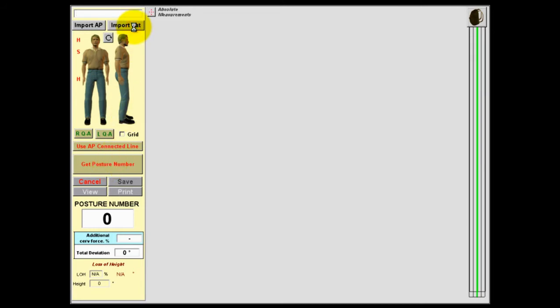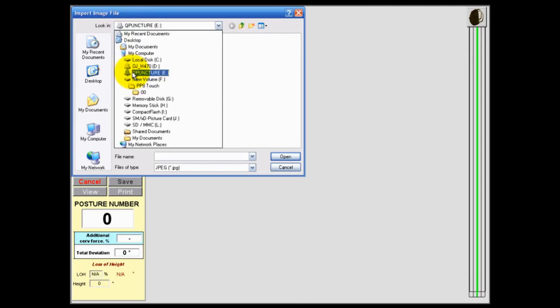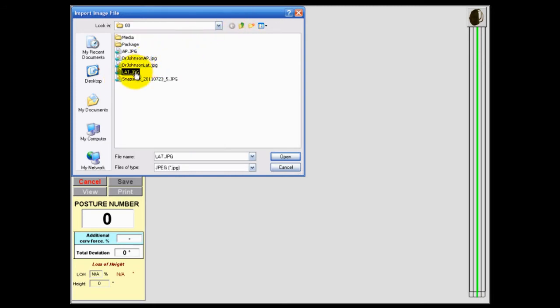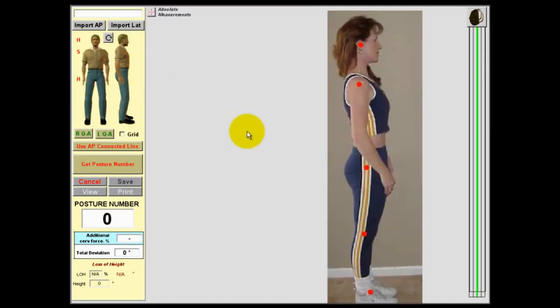Let's bring in a sample picture. We click on the Import A to P or LAT button, then click on the image we want to import, and it appears on the screen. In a screening situation, we only want to measure five anatomical landmarks: the center of the ear, shoulder, hip, knee, and ankle. To speed the process up, we've created hyper jump points so that Posture Pro will immediately go to the next point for evaluation. To activate that, we click on Get Posture Number on the left, and the software immediately jumps and greatly magnifies the image for greater precision.